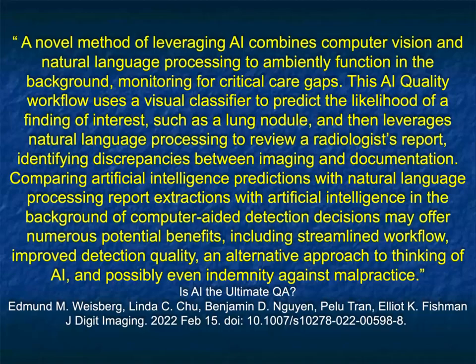So really what you're doing is you're combining computer vision and natural language processing to function in the background, monitoring for critical care gaps. This is, in some sense, you can say it's great for AI, but it's also great as a way of improving accuracy without interrupting the physicians. There's always the concern of perhaps the radiologist will get interrupted by the AI, but in this scenario, they will not.